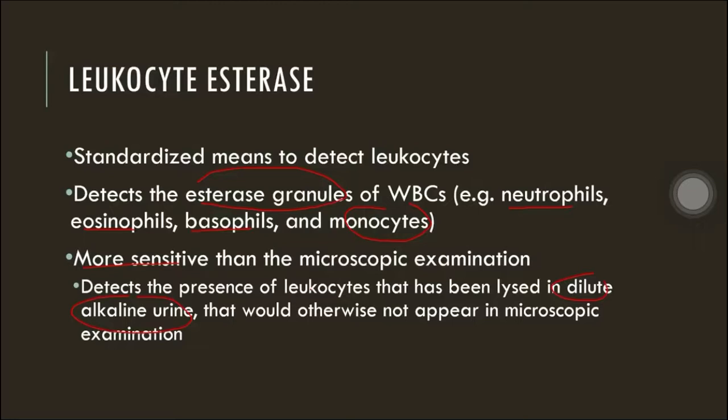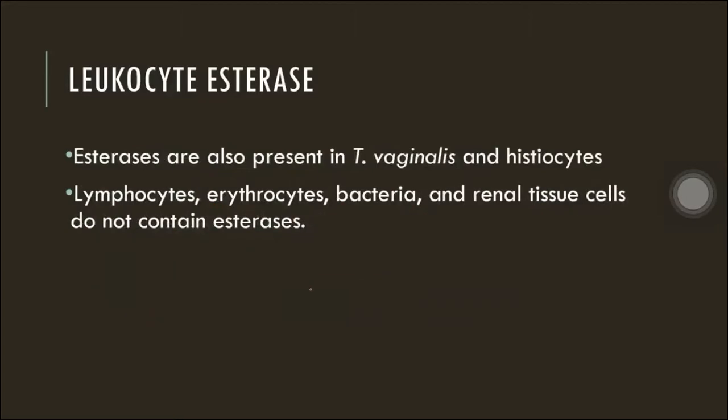Okay, so ano mangyayari kapag lysed yung WBCs? So may tendency na ma-miss ng medical technologist yung WBCs sa microscopic. Okay, but that doesn't mean that leukocyte esterase will have a negative result. Okay, but still, kasi nga naman ang dinedetect ni LE or leukocyte esterase is the presence of the granules. So kahit mag-lyse yan, madedetect niya pa rin yung granules. So esterases, aside from granulocytes, are also present in Trichomonas vaginalis and histiocytes. Histiocytes are macrophages in the connective tissue. Lymphocytes, erythrocytes, as I said earlier, lymphocytes. Bacteria and renal tissue cells do not contain esterases.